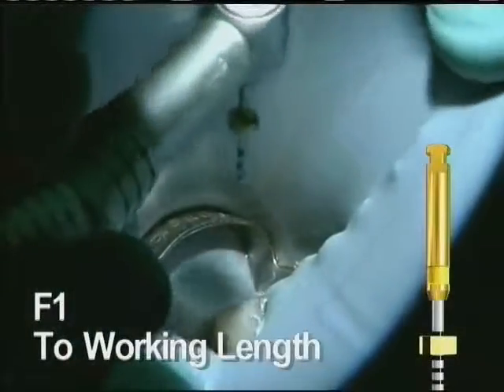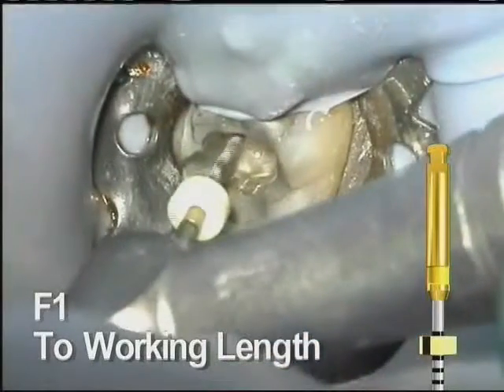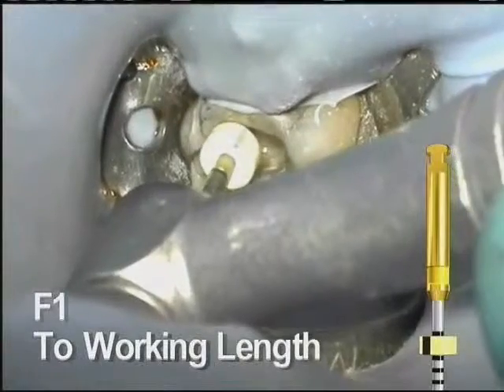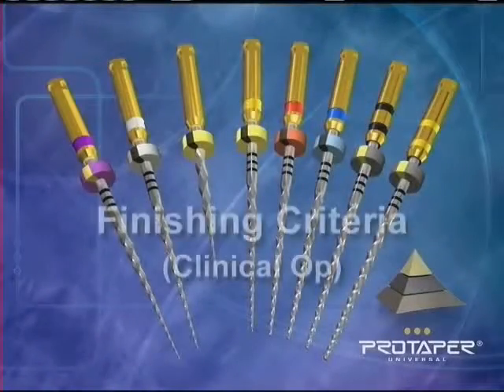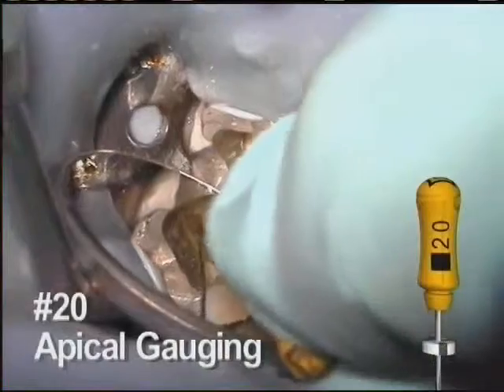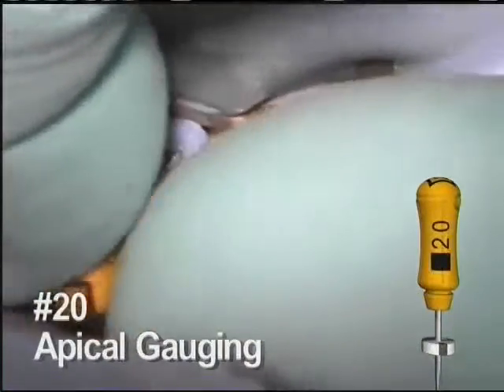Finishing file number 1 is taken to length. This instrument has a 20 tip and decreasing tapers. It will provide deep shape but do almost no work in the coronal portion of the tooth. Apical gauging with hand files is suggested to determine a final apical shape.